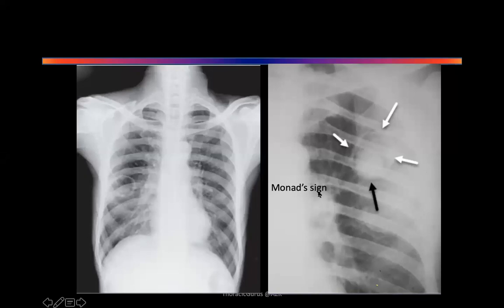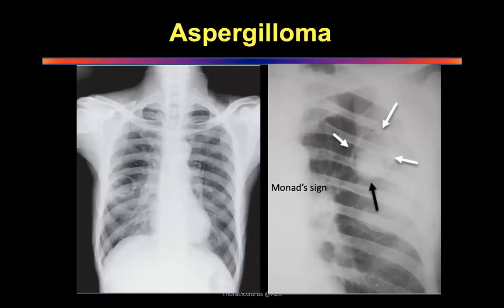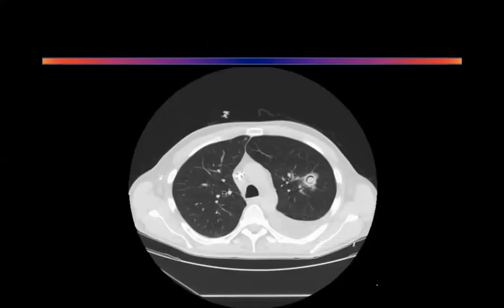Very good. Diagnosis. This could be aspergilloma. Lung abscess or an aspergilloma, sir? Aspergilloma first. I would also say this could be an early hydatid cyst. We don't know that as yet. It's not very clear cut. But aspergilloma will be my first choice. Lung abscess less likely, more likely to be an aspergilloma. Okay, well done. Continue, Vivek, just describe this.